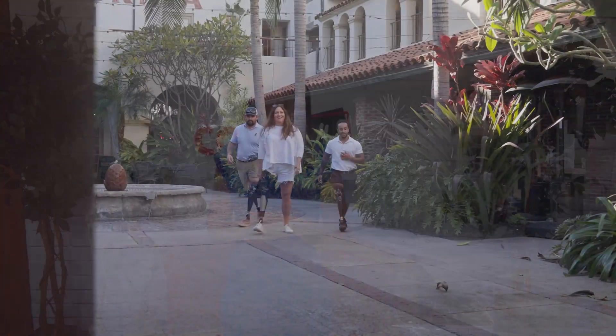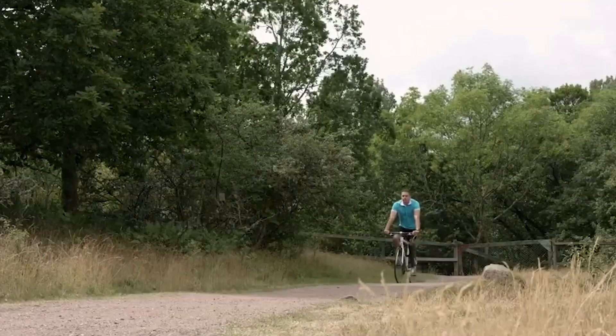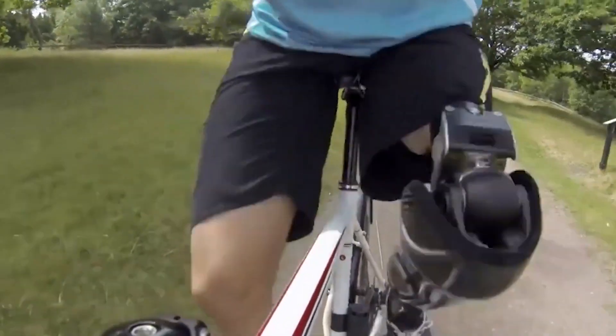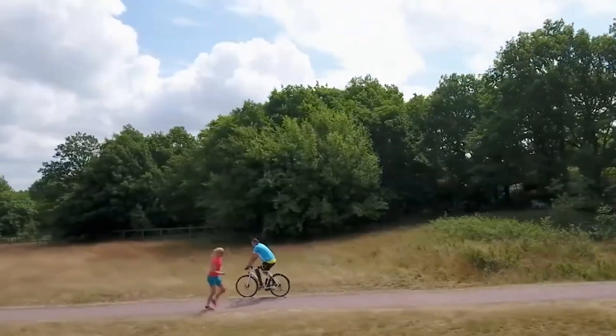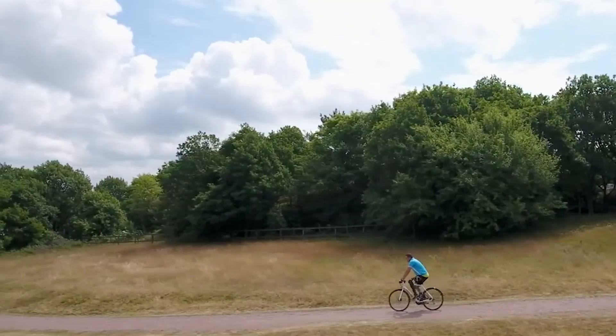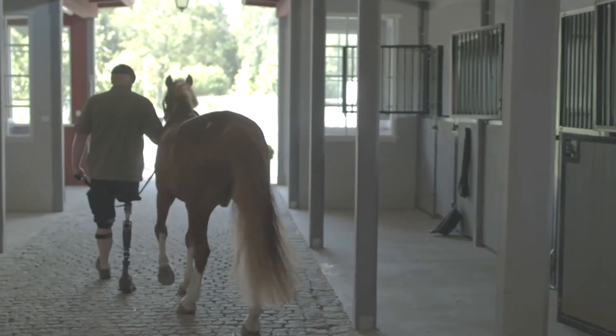The OPRA implant system is the only FDA-approved osseo-anchor technology available to amputees in the US and is also used in over 13 countries around the globe. It allows those who have been unsuccessful with traditional sockets to get back to walking and improving their mobility — folks with sensitive skin that's constantly breaking down, especially those with grafted skin, those with very short residual limbs, and those who have issues maintaining a stable limb volume, which makes it difficult to get a good socket fit.